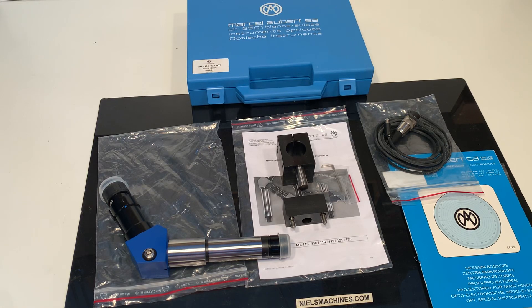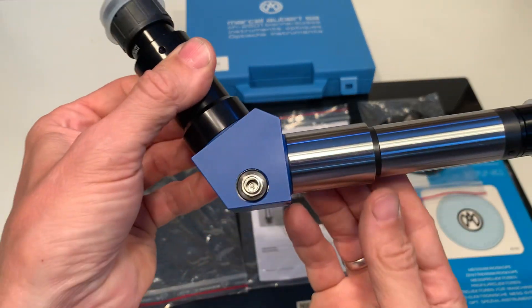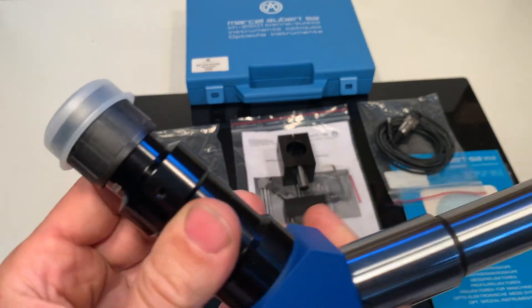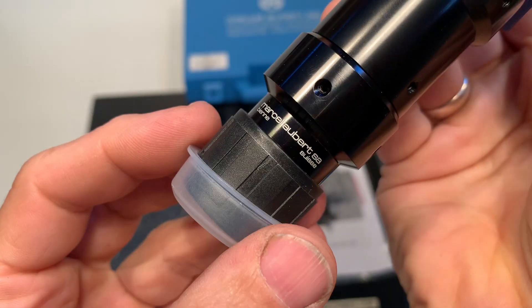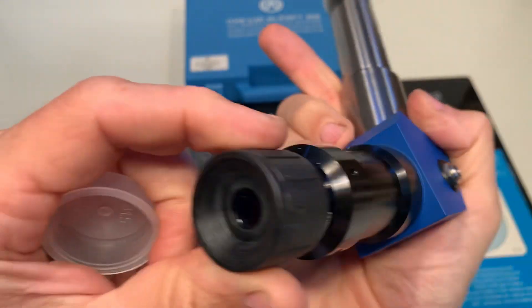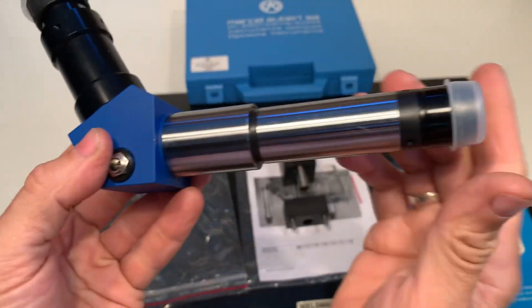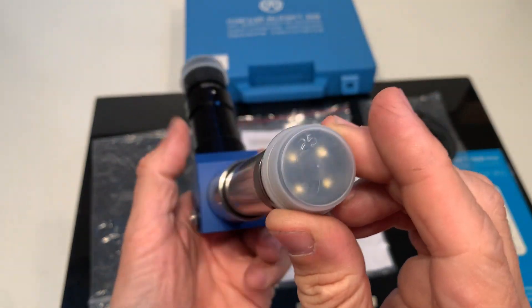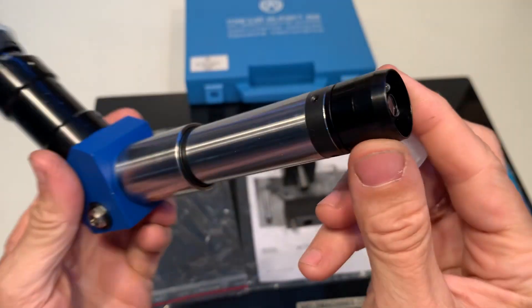Here I have a Marcel Aubert centering microscope. It looks like it has never been used, and I will sell it as NOS (New Old Stock).